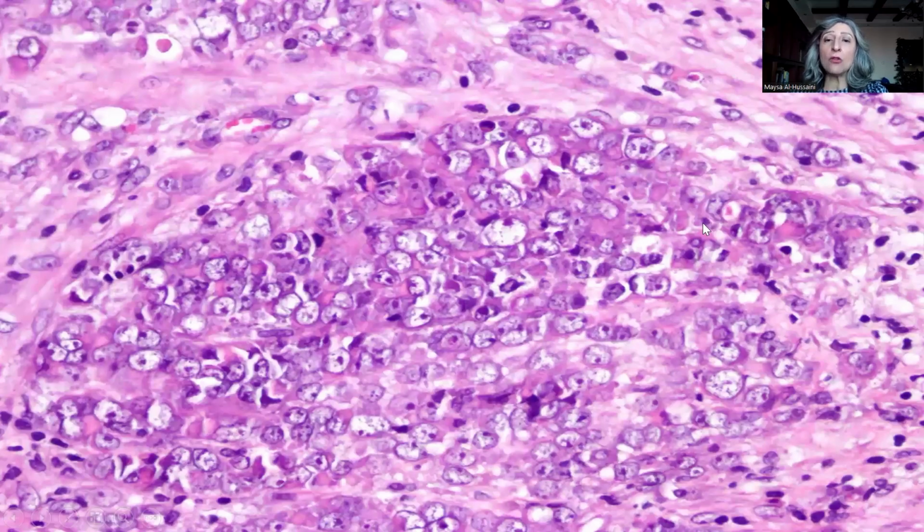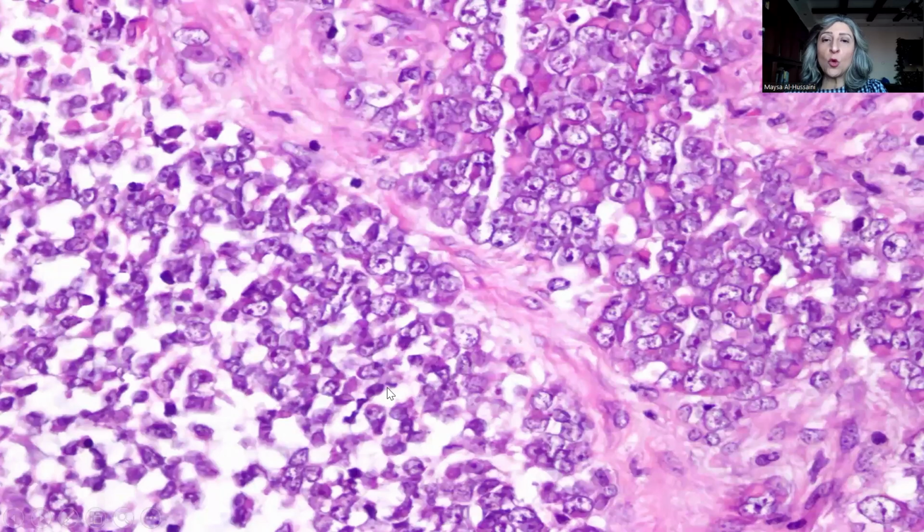And again, another focus where you have this nodule with the tumor cells showing this vesicular nucleus, very prominent acidophilic nucleolus, and then this globule in the cytoplasm that is acidophilic and pushing the nucleus to one side, giving this appearance that is reminiscent of rhabdomyoblast, but in reality these are not, hence the name rhabdoid tumor.